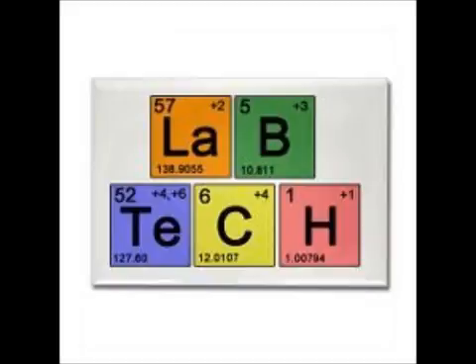So what is this? Anybody? So 1.69 or 1.7. So what would the doctor do for that patient? Increase it, or they would say, check, and maybe we need to change your diet. What have you been eating this last week? And then everybody who goes on Coumadin should get a sheet of what to avoid. So if it's that close to 2, you might want to look at their diet. Because we have some that get in check right away, and then you have some that are coming back every day for a protime. They can't get it up to the right level.